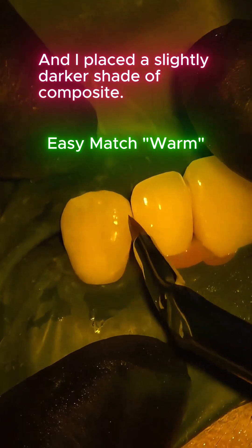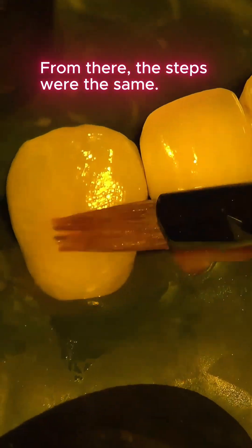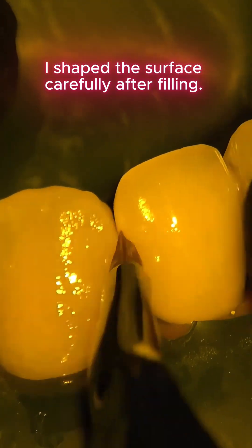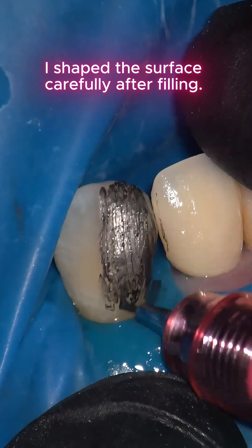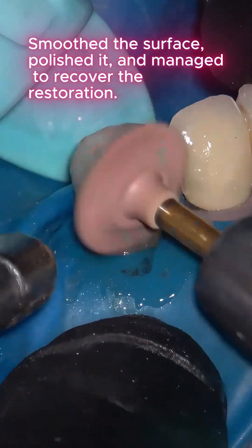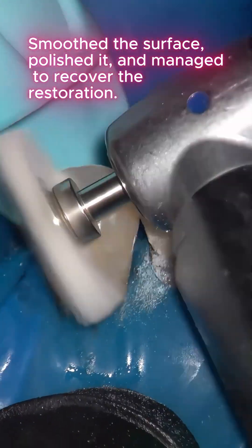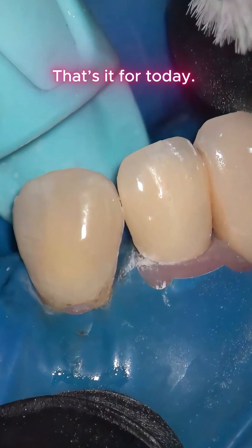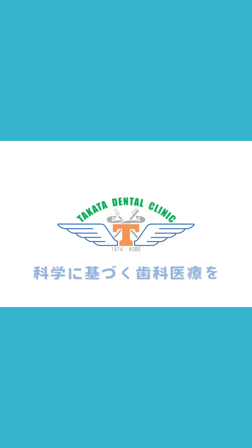From there the steps were the same — I shaped the surface carefully after filling, smoothed the surface, polished it, and managed to recover the restoration. That's it for today. Science-based dental care, Takata Dental Clinic.